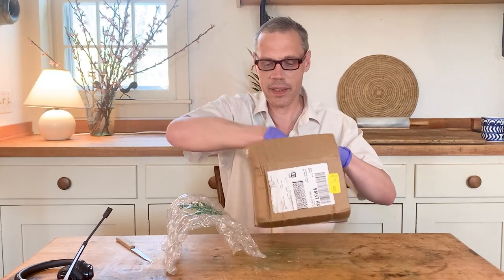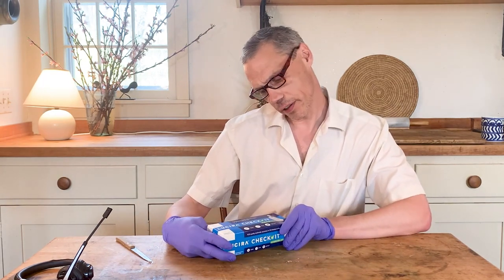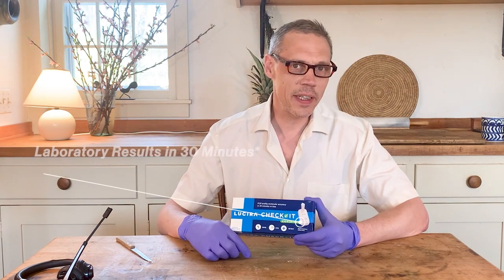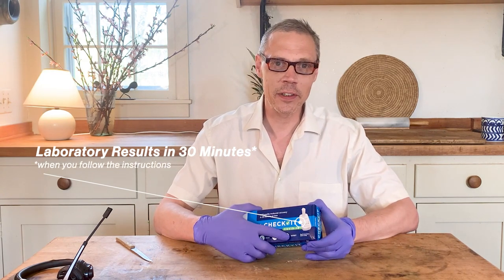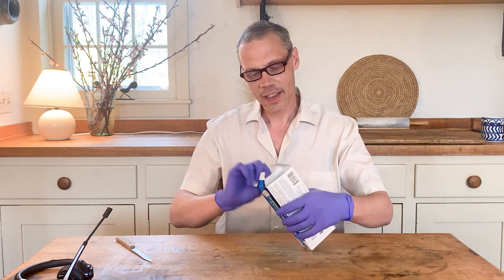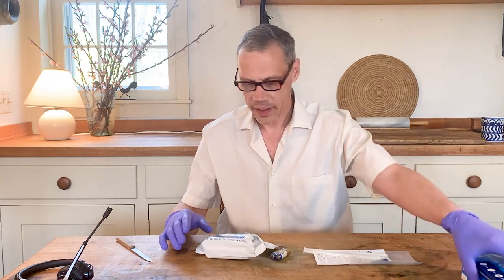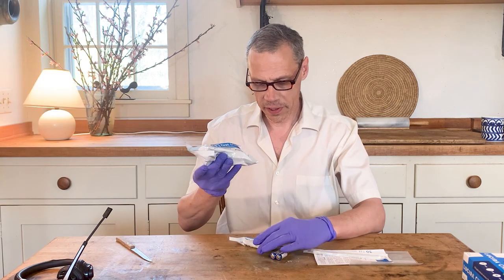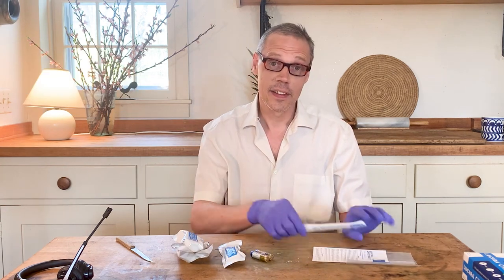Okay, bubble wrap. The Lucira Check It, it's called. Just swab, stir, and detect. Laboratory quality results in 30 minutes is what it promises. And it says please read the instructions before using, but I'm not going to do that — I'm just going to go ahead and do it and see if it's idiot proof. Opening the test: number one, test unit; please insert batteries; sample vial; a couple of batteries; and a swab. I think this is going to go up my nose.